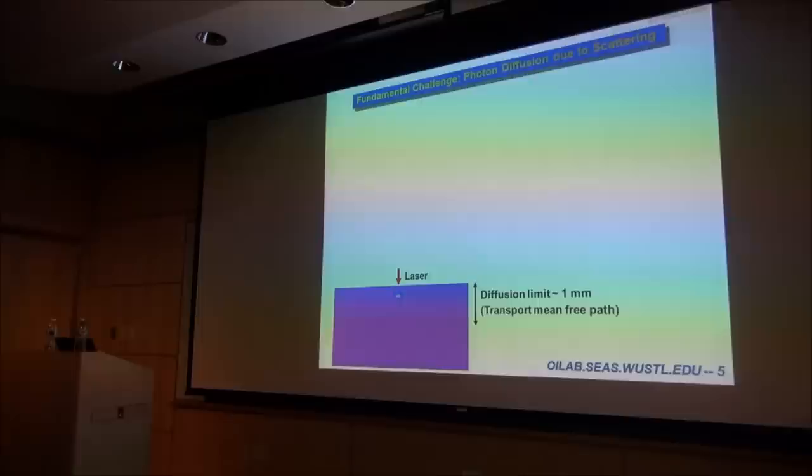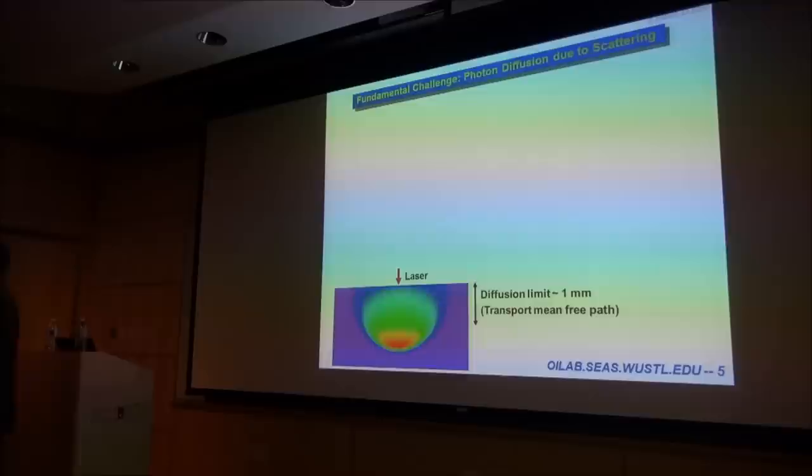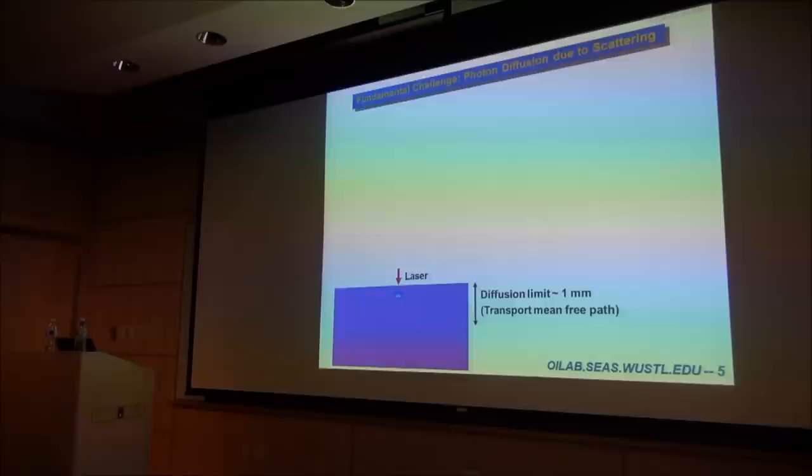Where's the challenge? In addition to diffraction, as we know, diffraction means you can get lambda over 2 resolution when you do your best in focusing light. A major challenge is photon diffusion due to the very strong scattering of light in tissue.